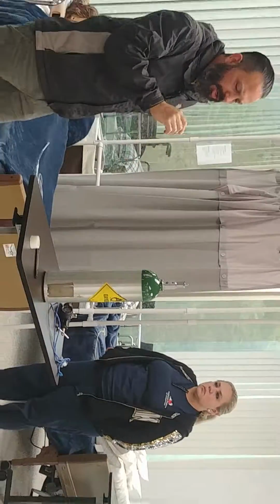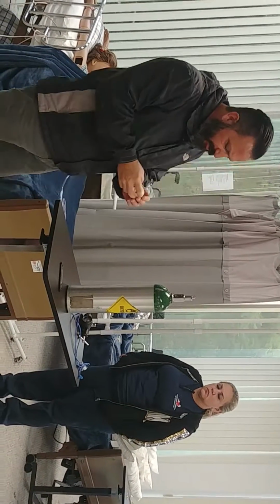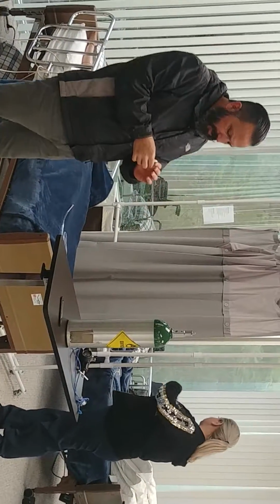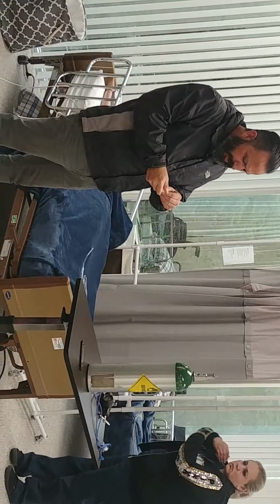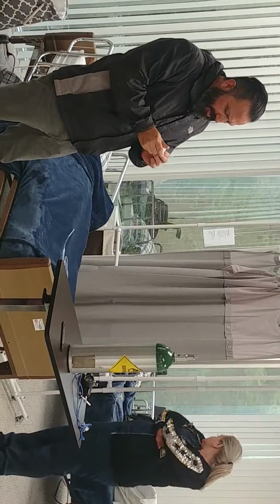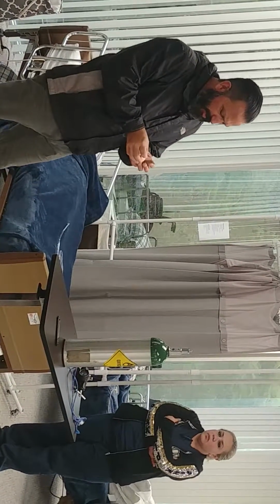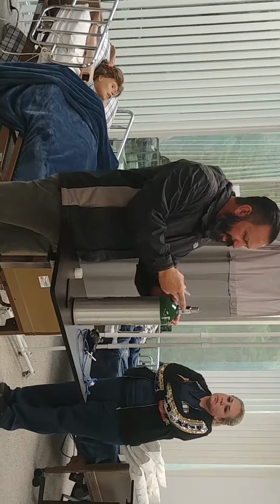The first thing we're going to do is grab a new bottle. I want to simulate this so you get a better idea of what you're going to be looking at when you bring a new bottle over. These new bottles are going to be secured and presented. You see these open ports?